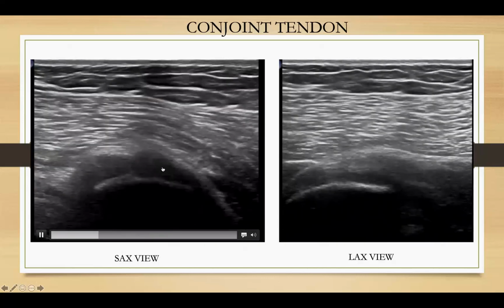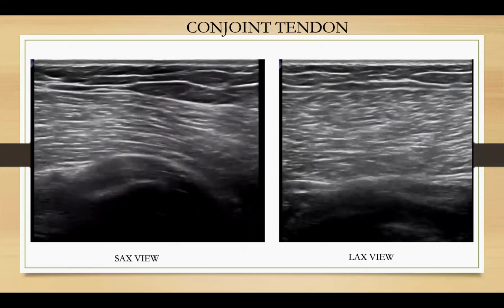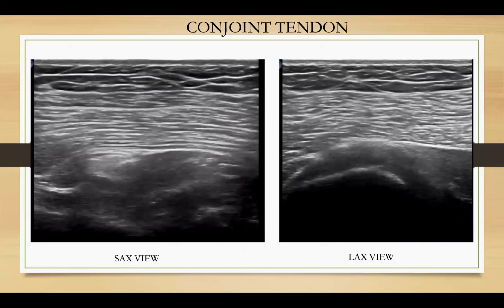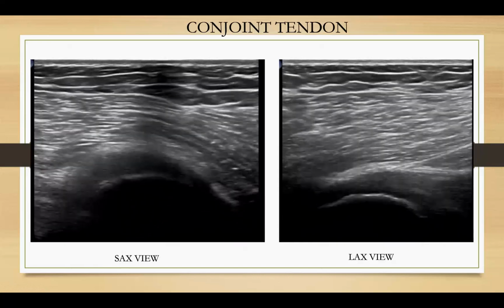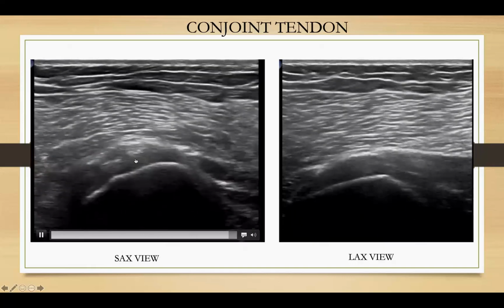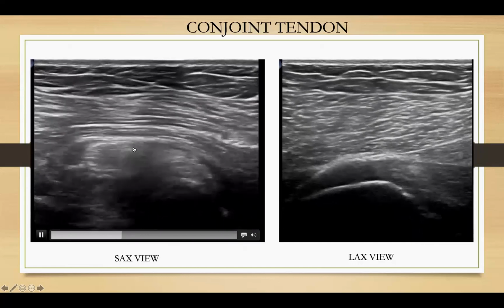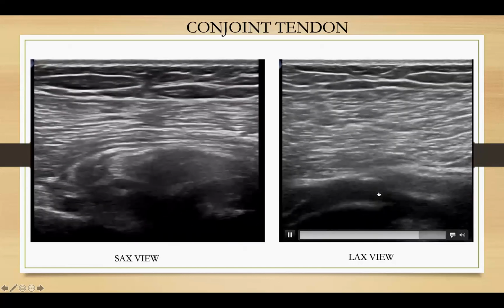As we scan through the area, I'm constantly having to heel toe and wag the transducer to help overcome the anisotropy that is inherent in this area. You should also note that the tendon arises from a relatively posterior and somewhat lateral position. Also take note that the first muscle tissue that you see here arising off the tendon is actually the semitendinosus muscle.